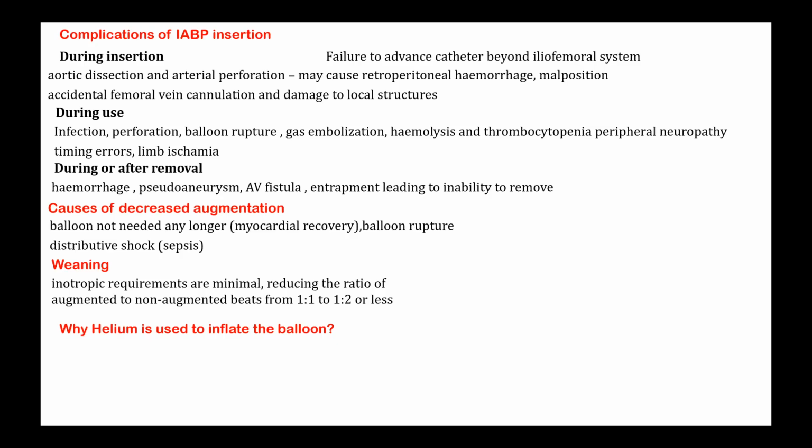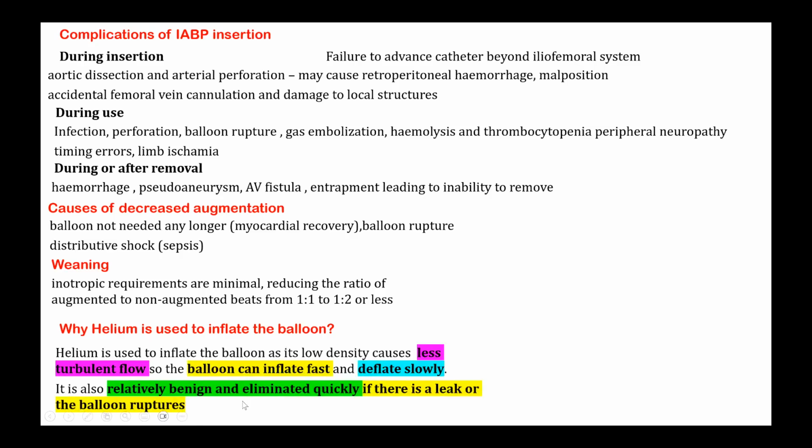Right. So helium is used to inflate the balloon because of lower density. So less turbulent flow as the balloon gets inflated, and the inflation will be fast and deflation slow, because of this factor of low density. And also it is benign, it is called an inert gas. So it will not cause any problem even if the balloon ruptures and the helium mixes with your blood, nothing will happen.